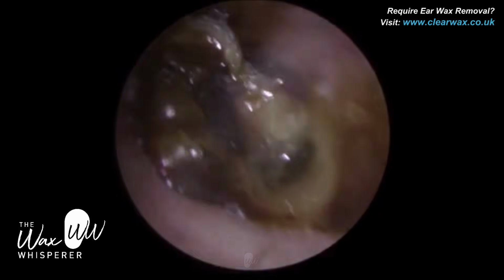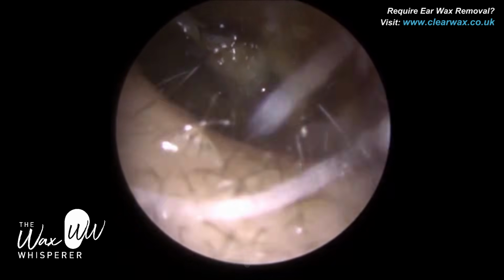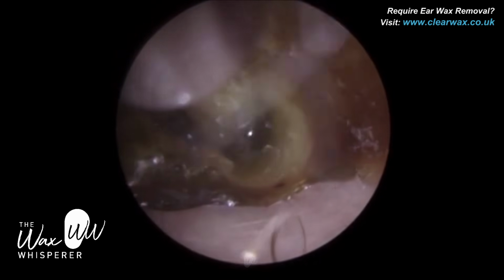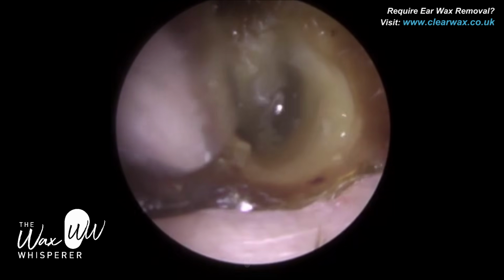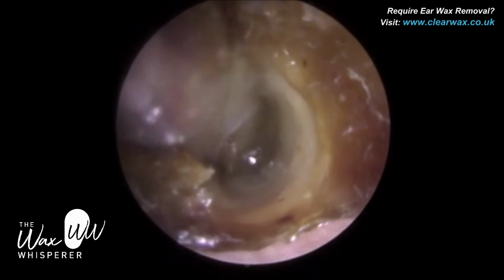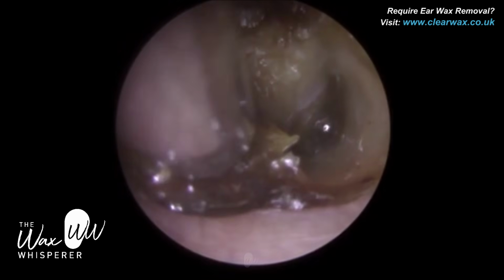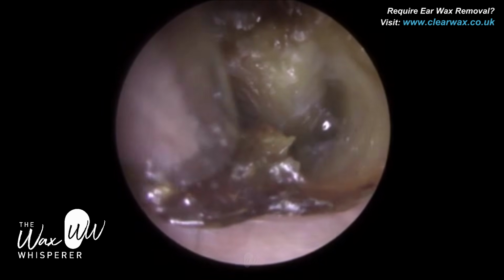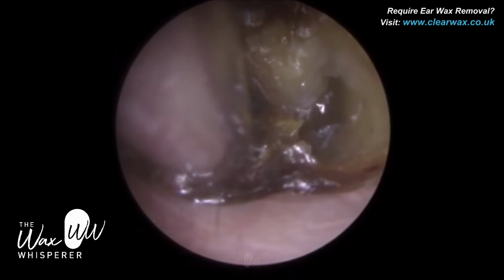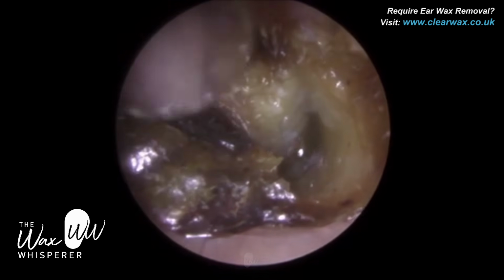So what is a cholesteatoma now? I'm going to talk about a cholesteatoma whilst I'm showing you the procedure. Now at this stage I wasn't aware whether or not the patient had a cholesteatoma also in the left ear. It's very difficult to ascertain. So you'll see me in this left ear being very gentle, very delicate, because with a cholesteatoma you do have to be that. Sometimes a cholesteatoma needs to be removed surgically following a CT scan and general anaesthetic.